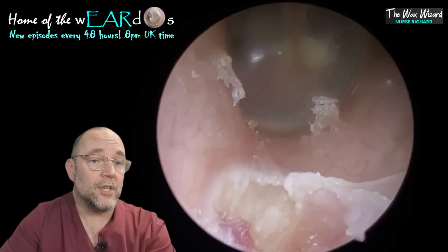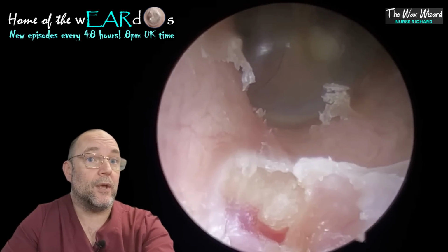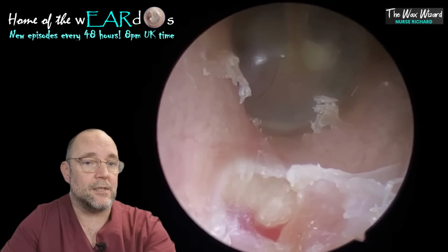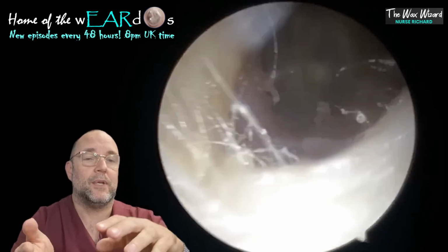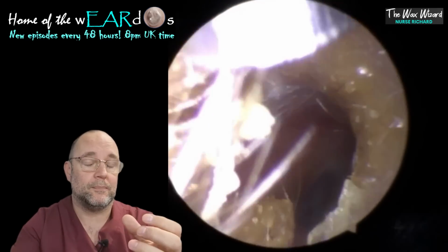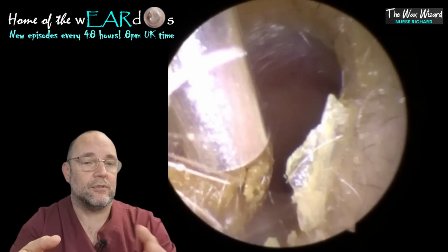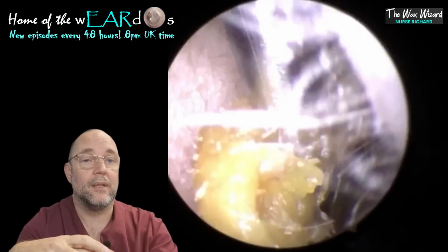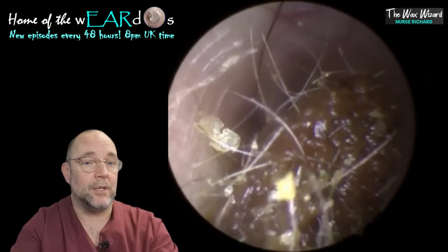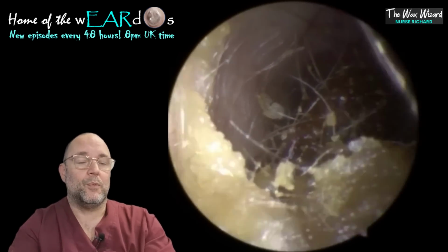So what's the cause of that? Actually, have a look right now. Can you see? And that was without us touching it. It just spontaneously started bleeding there. Now that's not because of what we've done to it. It's because of when we've removed this plug from it. There's obviously been some fresh granulation tissue there that's ruptured as it's been pulled away, and it's been filling up, and all of a sudden it started bleeding. It didn't bleed more than that. That was it, and we just left it at that point.